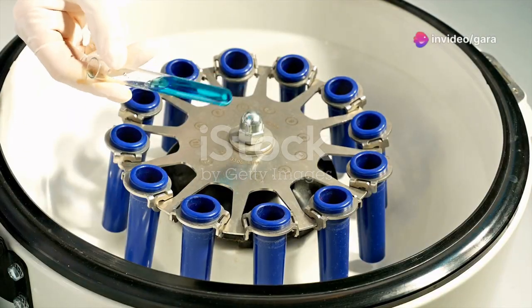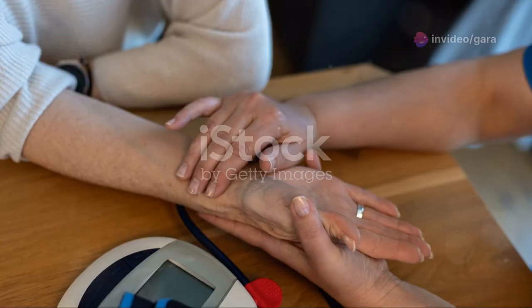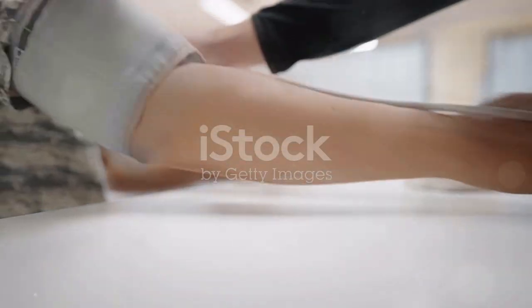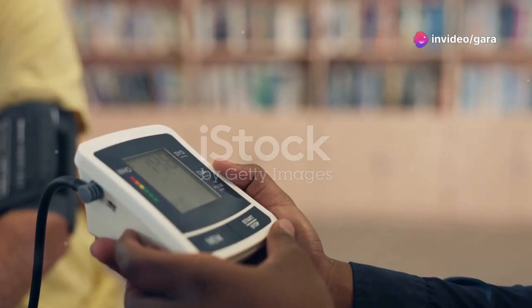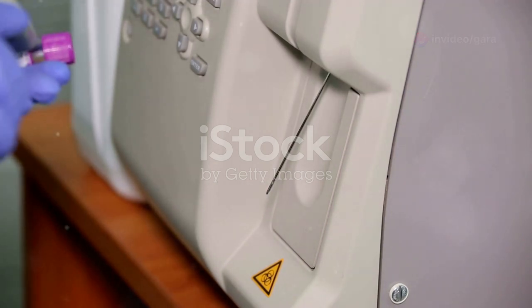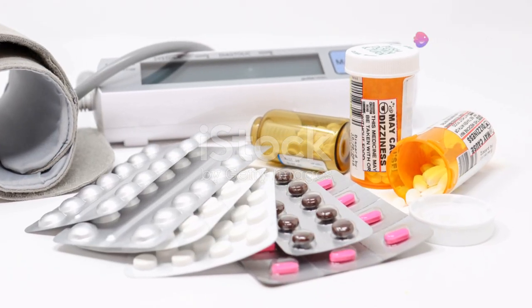It's the average pressure in your arteries during one cardiac cycle. From here, the device calculates the systolic and diastolic pressures. The systolic pressure is the point at which the oscillations start, representing the pressure when your heart beats. The diastolic pressure is when the oscillations end, representing the pressure when your heart is at rest. To sum it up, the pump inflates the cuff. The pressure sensor detects oscillations as the cuff deflates, and the algorithm calculates the blood pressure from these oscillations. It's a brilliant interplay of mechanics and math.